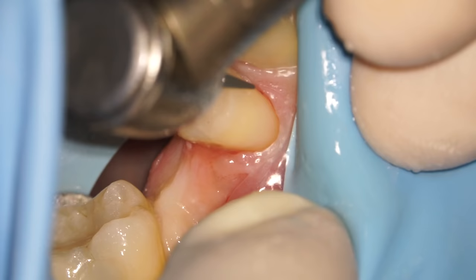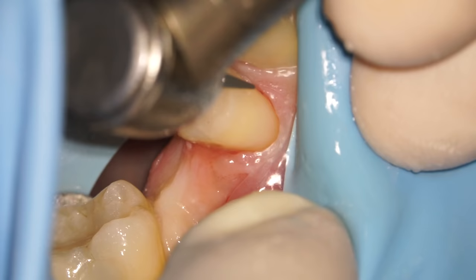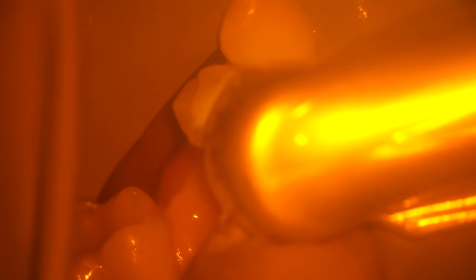It's really critical because the gums are going to grow back after this procedure even if we nicked them a little bit, but a bad filling will not go away on its own. So it's better to traumatize the gum tissue a little bit and make sure the filling is super smooth — a week from now that tooth will have a beautiful tissue response.